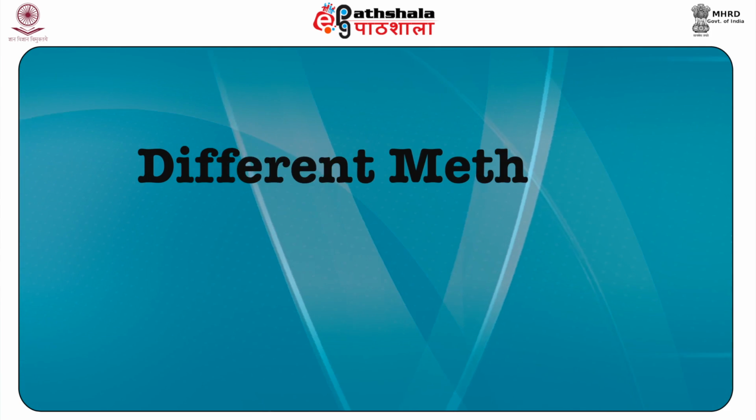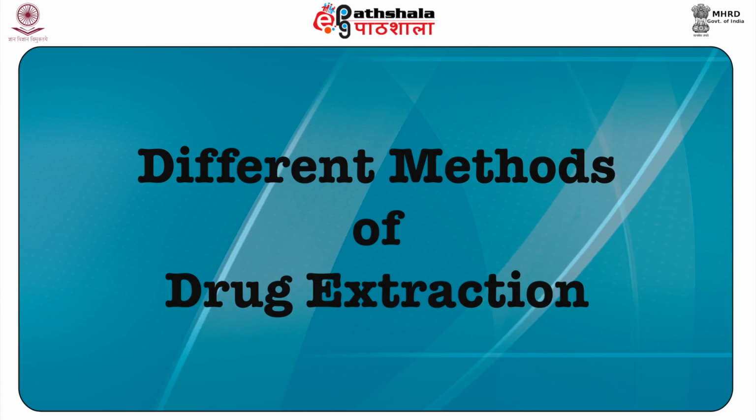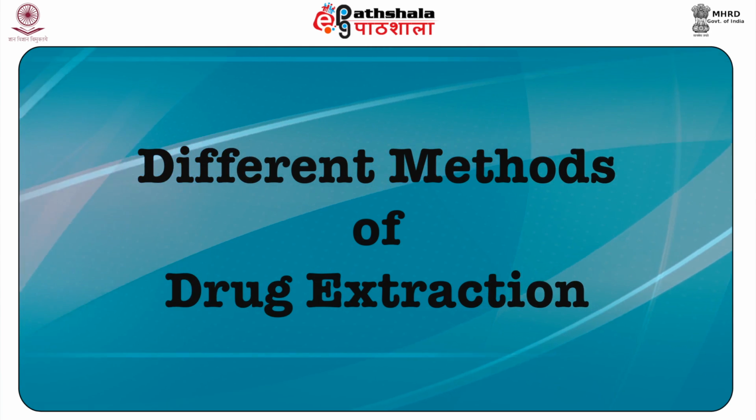The internal standard must simulate the physicochemical properties of the analyte as thoroughly as possible and must follow the target compound through the entire process of extraction and subsequent analytical steps in order to compensate for any loss of the target compound. Next are the different methods of drug extraction.